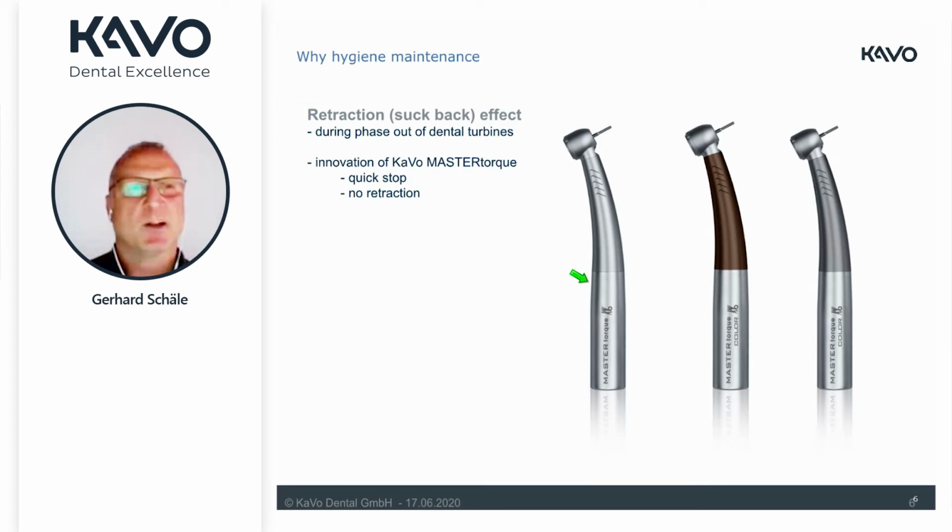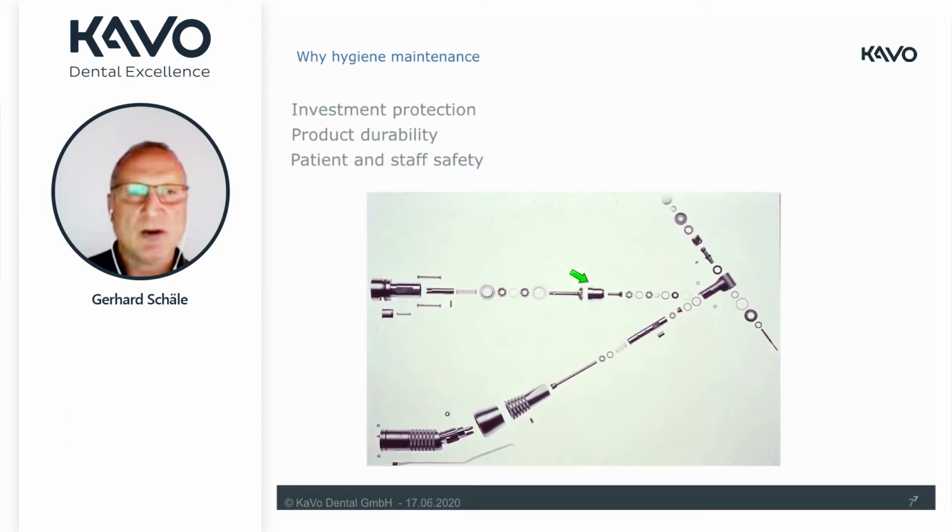Even if the turbine will be sterilized later on, we want to make sure that from the very first beginning we have no particles sucked into the inside because of the phase out time of the turbine. How do we do this? We want to show it later on.